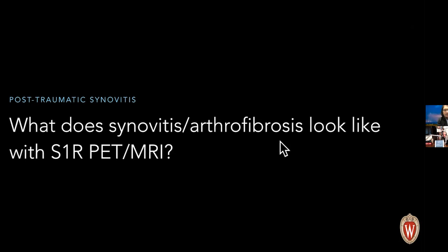So this is a gentleman who had sustained an athletic injury and ruptured his ACL, and was hopeful that he could go back to doing his athletic training. But unfortunately, after the ACL repair, had even worse pain than what he had sustained following the injury, and was quite upset and disappointed. He asked the surgeon, what's going on? I can barely walk. He was almost wheelchair bound. They had performed 2 MRIs, and the surgeon, and I think rightfully so, it looked like a post-surgical knee. It looked like a very typical knee that you would see with someone who had undergone an ACL reconstruction.